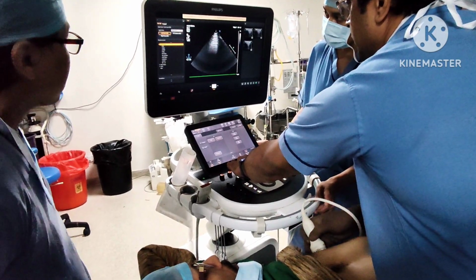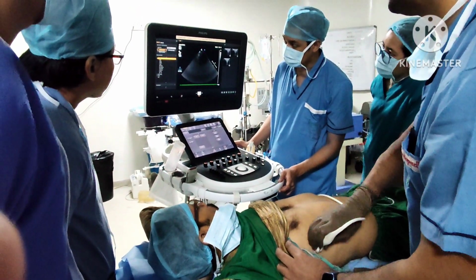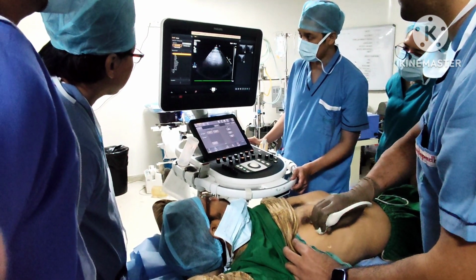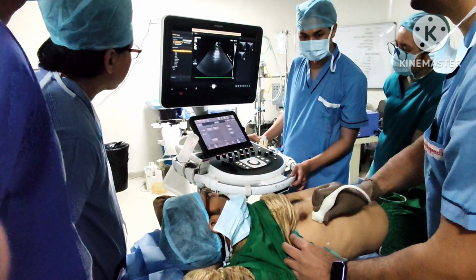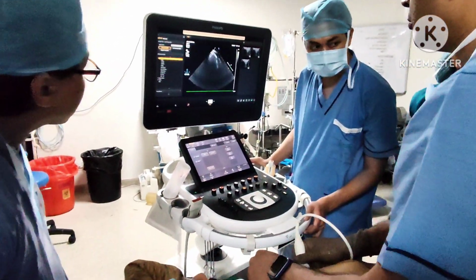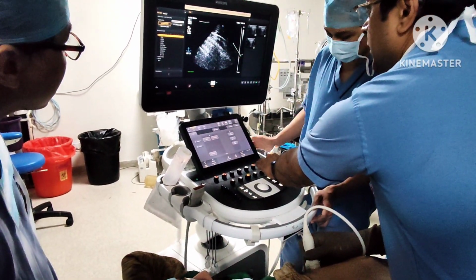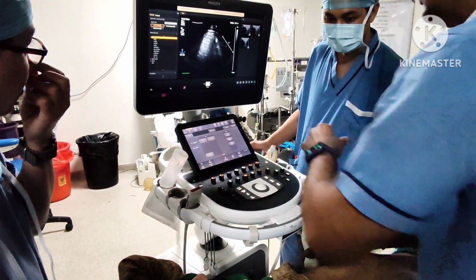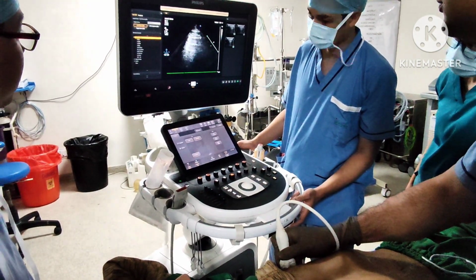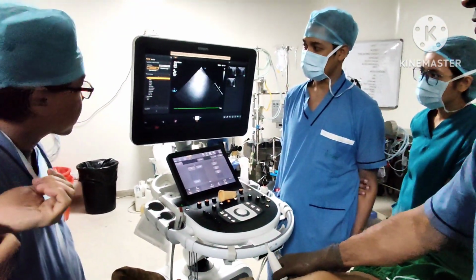It's not the best way of doing it, but let me see if I can do it. Let's come to the other side. Not so good as the linear probe, right? The depth is too high. The jelly is basically going down there.